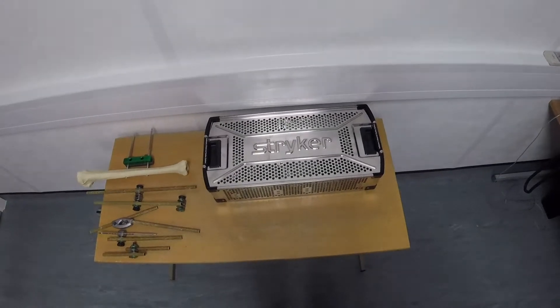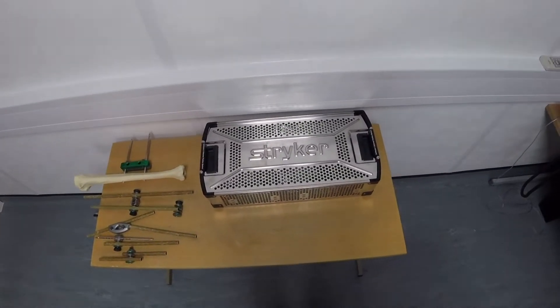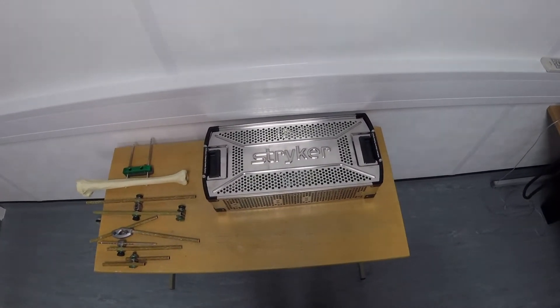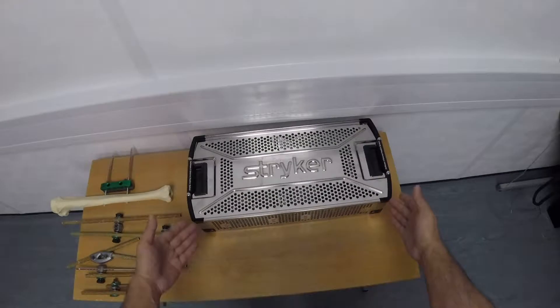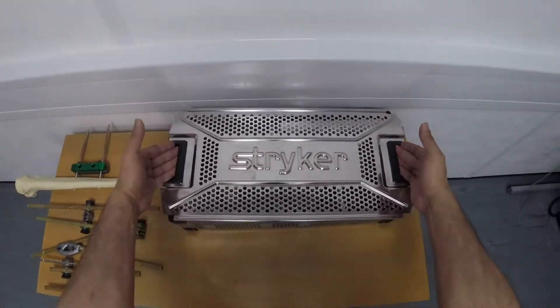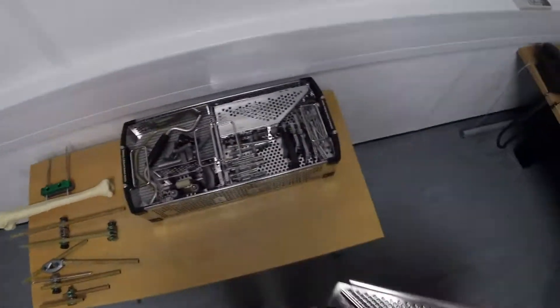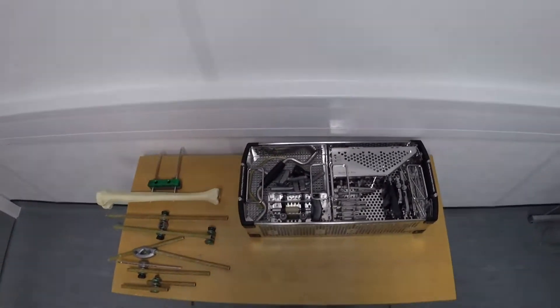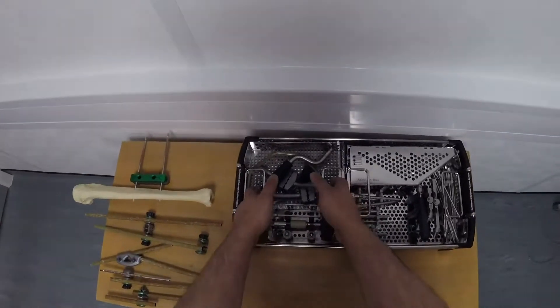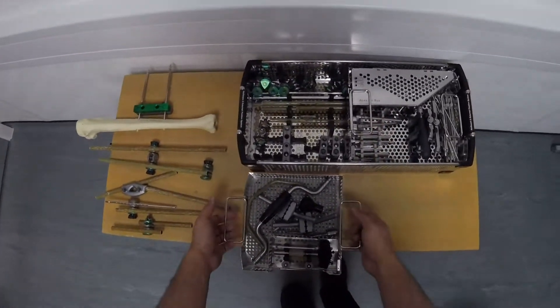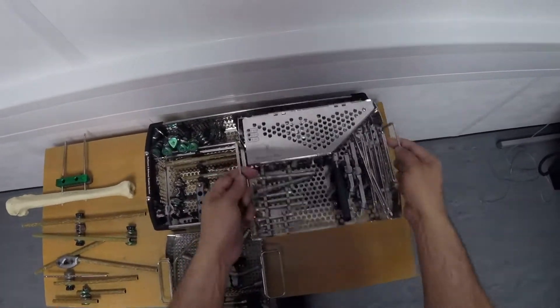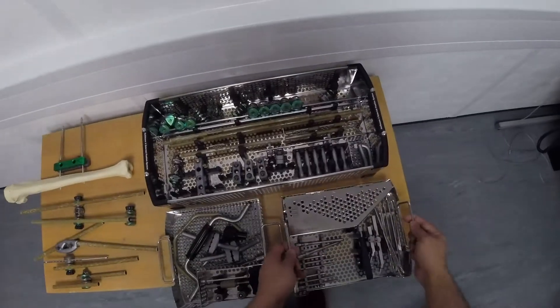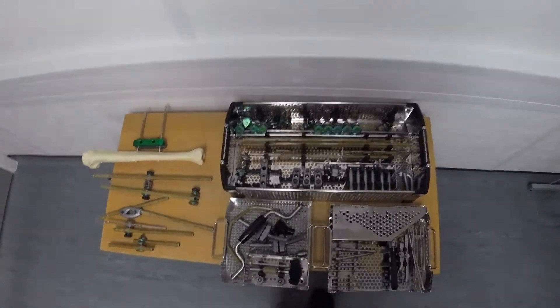In this podcast we're going to have a look at the Stryker Hoffman 3 external fixation system. I'm going to remove the lid by pushing in from the handles. We can see that the set is arranged in two different layers. Separate them out and let's go through it bit by bit.